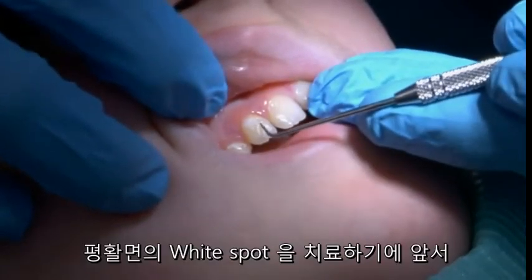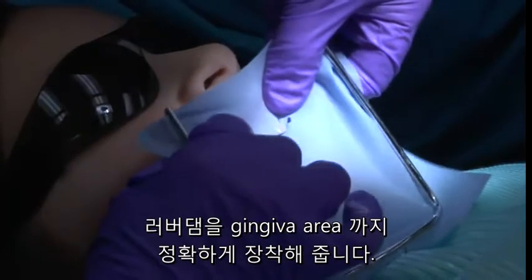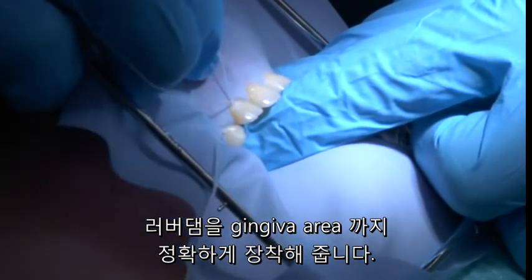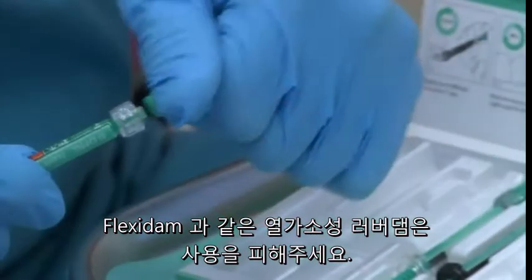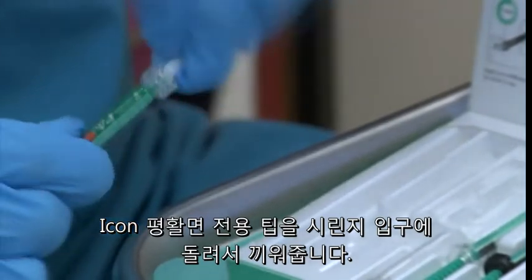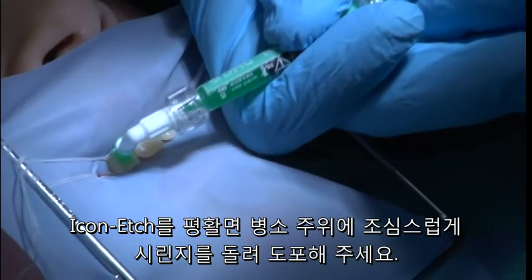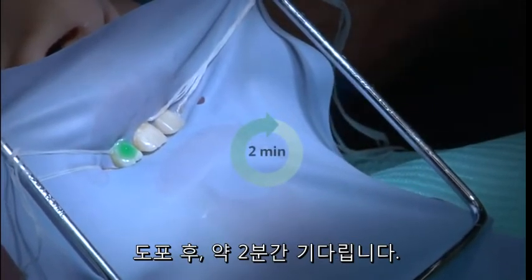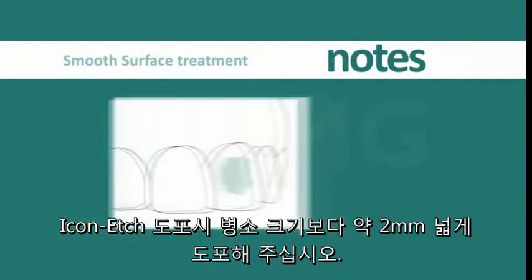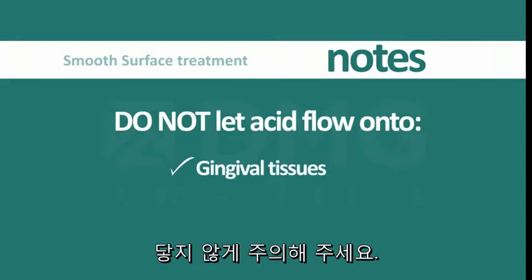To begin treatment of a white spot on a smooth surface, the tooth should be cleaned with pumice and then isolated with a rubber dam. The rubber dam should be well adapted and inverted at the gingival area. Do not use rubber dams made of thermoplastic elastomer such as flexi dam. An ICON Smooth Surface Tip is screwed onto the ICON Etch syringe. Apply the ICON Etch to the tooth surface by turning the syringe shaft carefully onto the lesion site and let it sit for two minutes. The ICON Etch should be extended about two millimeters beyond the lesion's margins.